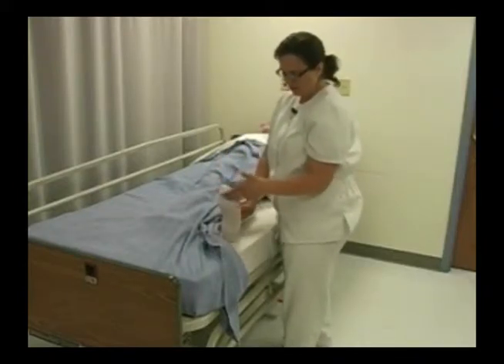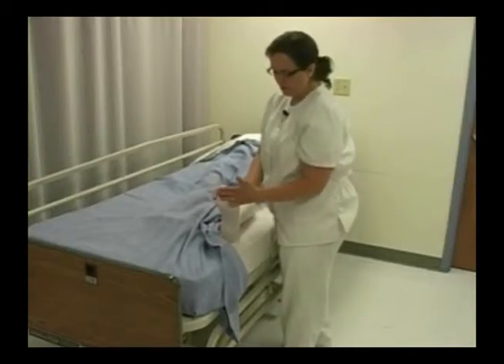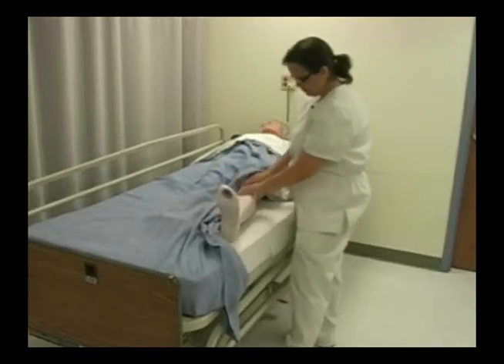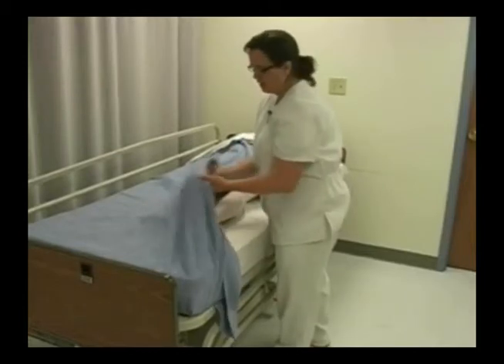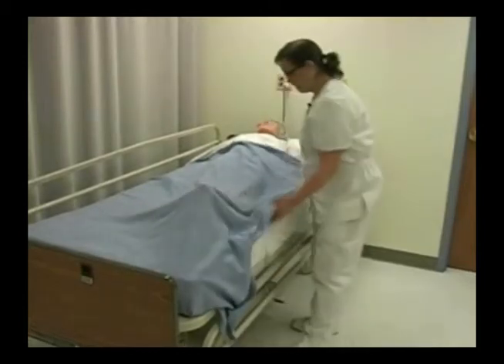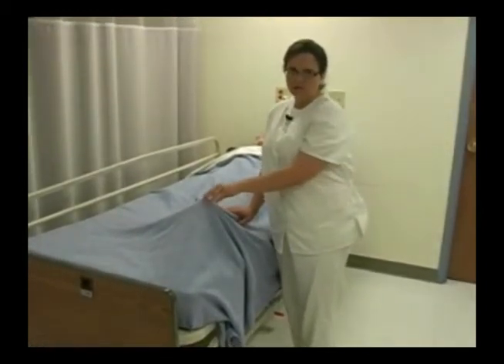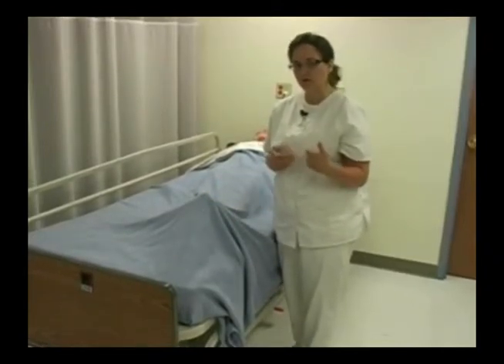These particular stockings happen to have the opening on the bottom. Some will have an opening on the top, and some won't have an opening at all. This is on nicely, and I'm going to repeat this procedure on my patient's other leg if it's ordered. If my patient was going to be getting out of bed, I would make sure to put on shoes or slippers. I'm going to take them off and reapply them according to the care plan.